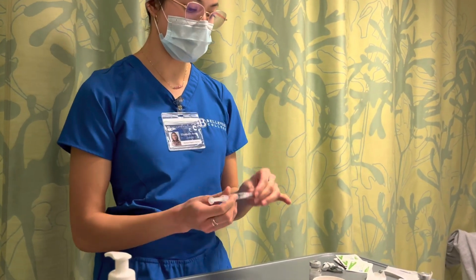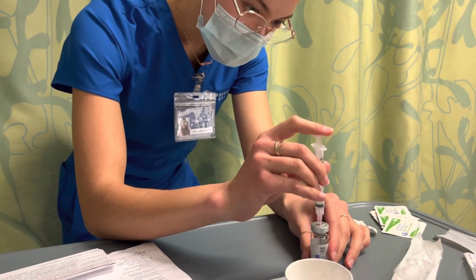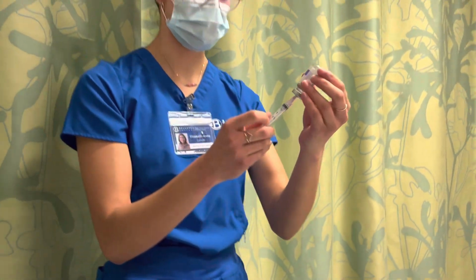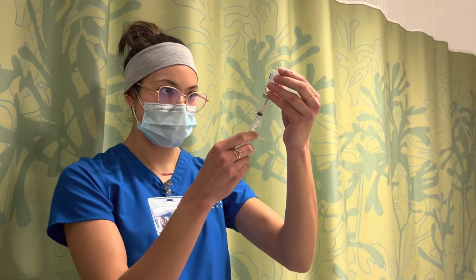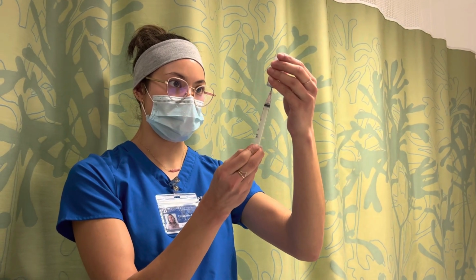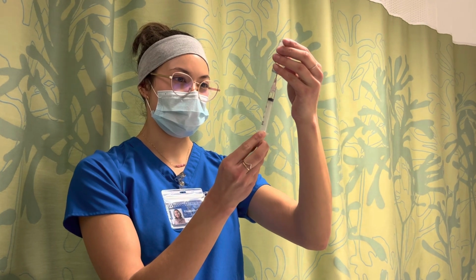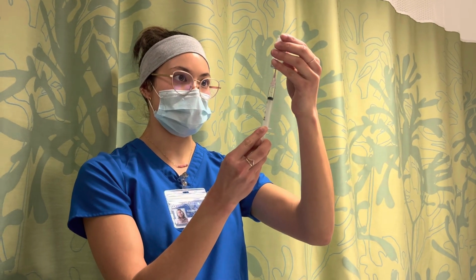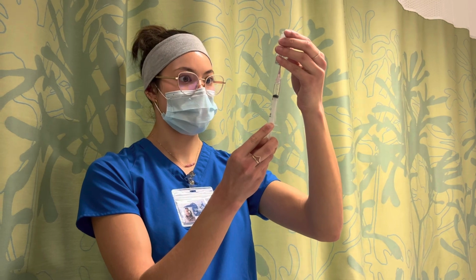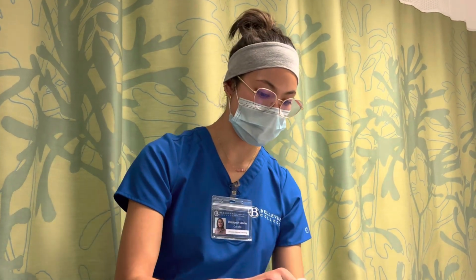Draw up a little extra, so that I can get rid of any air bubbles.